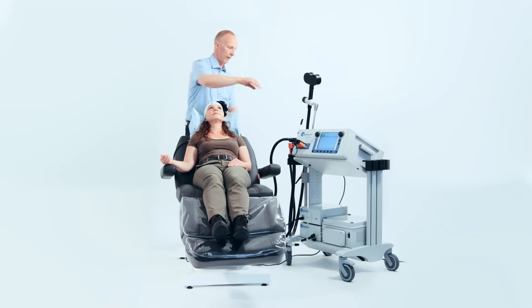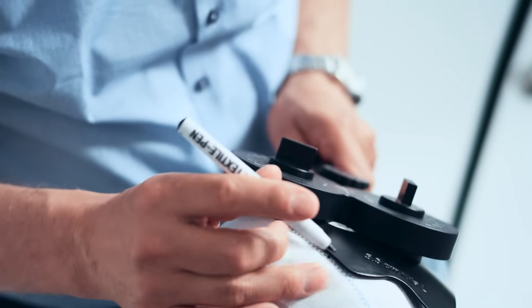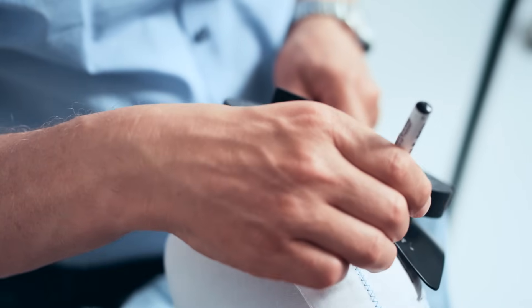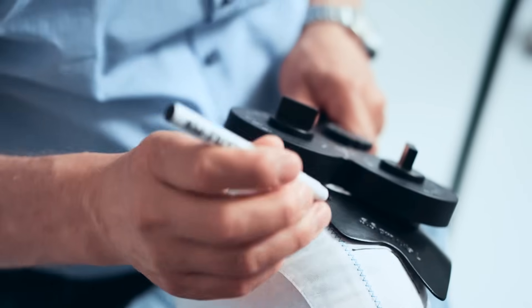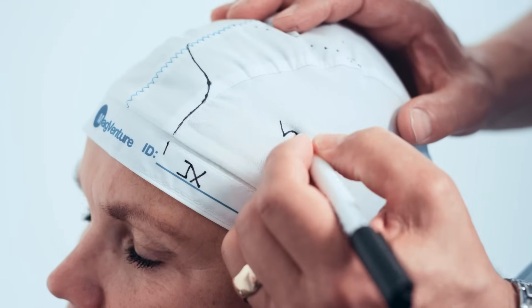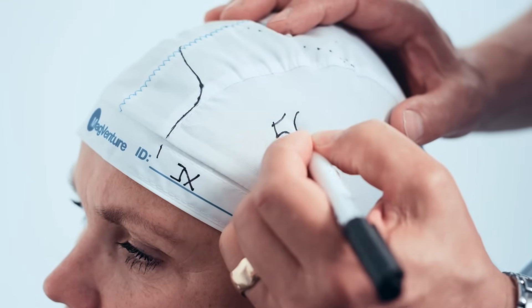While holding the coil firmly in place at this location, trace the contour along the front edge of the marking plate onto the treatment cap. This indicates where the treatment coil is to be placed. Record the motor threshold intensity shown on the MagPro in the patient's treatment records or on the side of the cap.